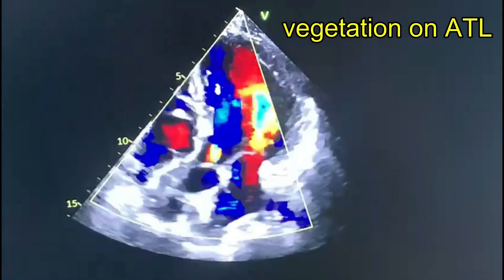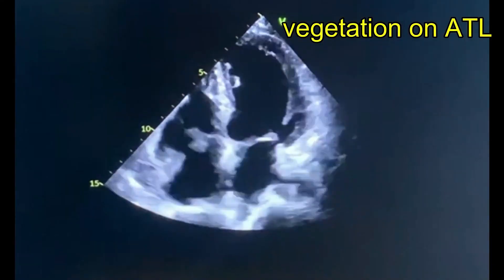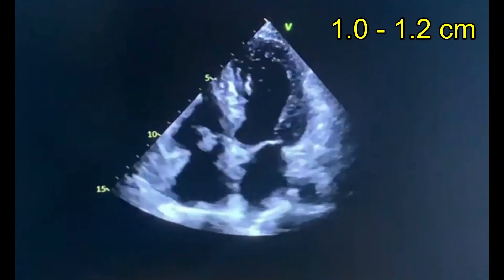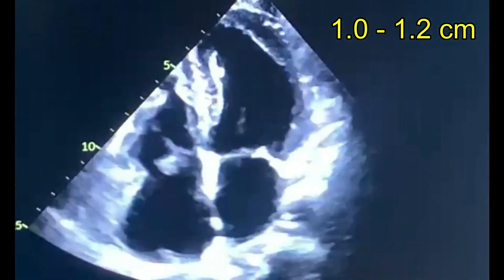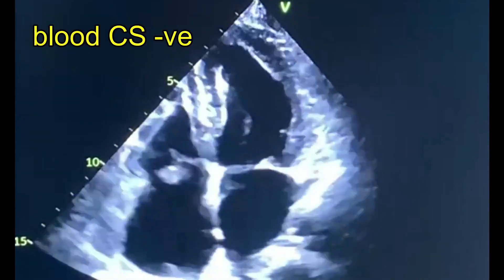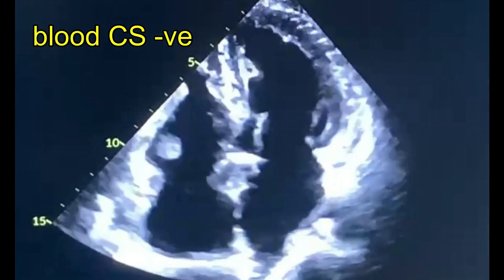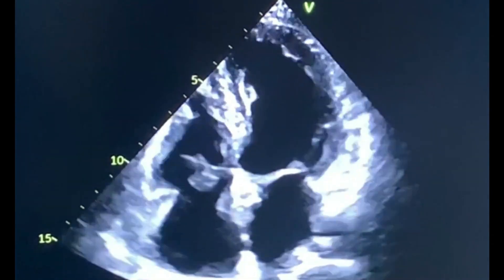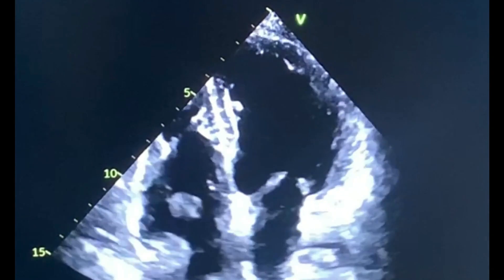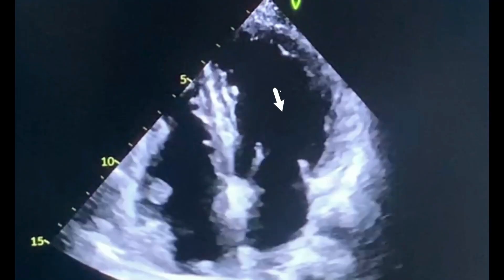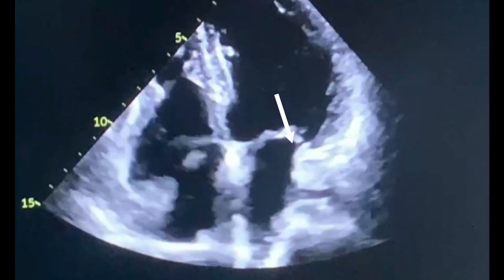The patient had mild to moderate aortic regurgitation with borderline left ventricular ejection fraction. The vegetation, or so-called mass, on the anterior tricuspid leaflet was suspicious, as both the right atrium, left atrium, and intra-atrial septum were normal. Both appendages were normal, the mitral valve opened very well, and there was no evidence of rheumatic heart disease, given the patient's age of 75 years.